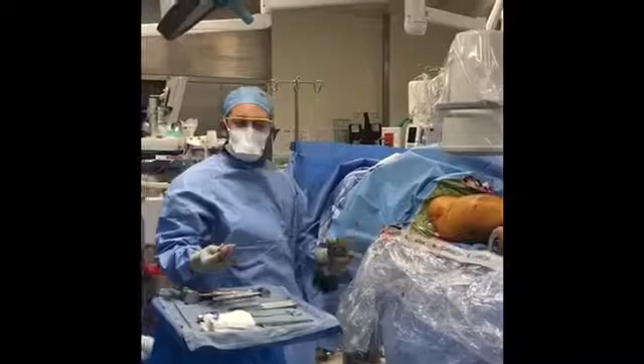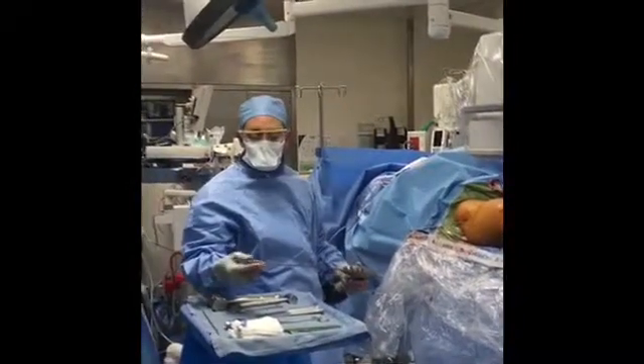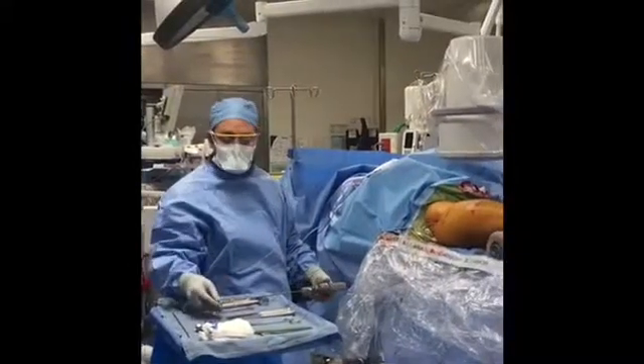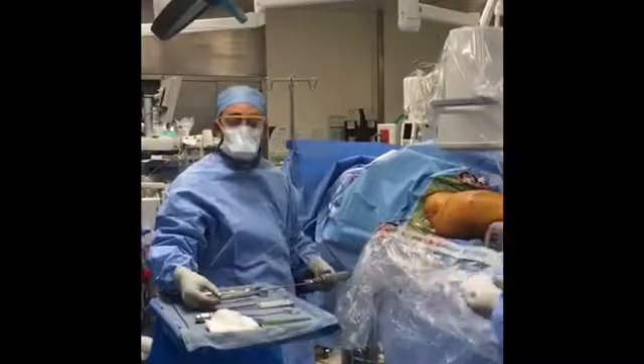The osteotomy site has been identified. We've drilled our holes and now we're gonna ream the femoral canal. This is gonna be helping us to seed those nice stem cells right where we want them.